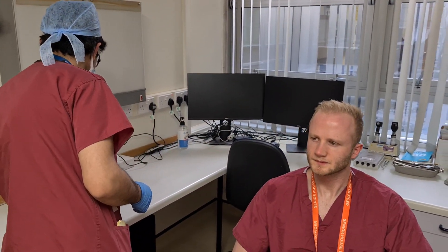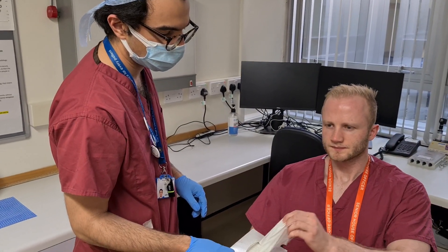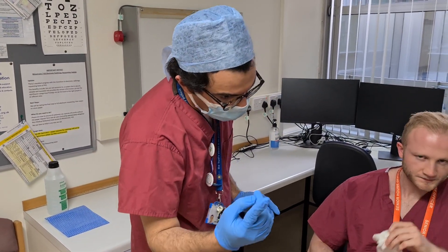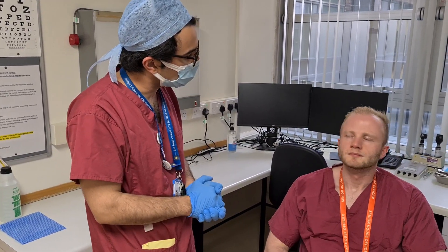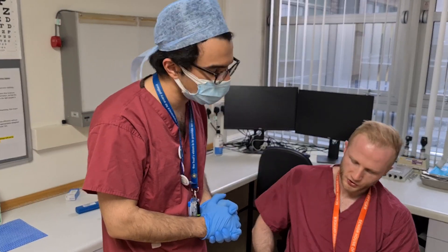If you just do a little sniff — I've got a couple of tissues here for you if you need them. As we're looking inside your nose, it shouldn't be uncomfortable; if it is uncomfortable at any time, just put your hands up and I'll stop.